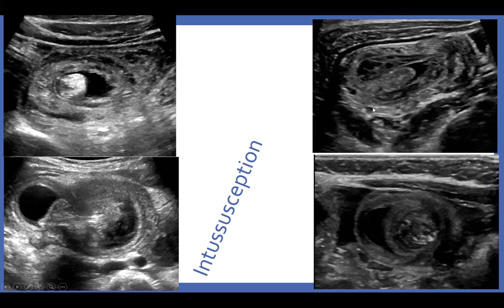So again, you can see another intussusception there. You stretch it out, you see the loop of bowel inside. I could show you many cases of this, and you say to yourself, okay, well, they all look the same. Well, yeah, I told you, it's typical appearance. But make sure you pay attention to that. I keep saying it, I have said it 10 times. I'm stressing it. Sometimes it may slightly change, but it will be the same.